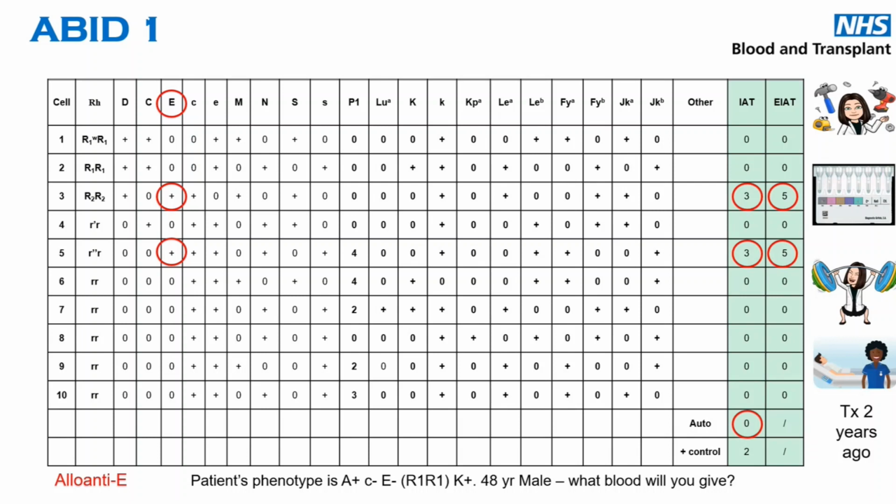So I've got an A. So what A would you give? A positive, A negative, A pos, big E neg. Any other takers? A R1, R1, Kel pos, yeah. AR1, R1 again, yeah. Yep. E neg. Just big E neg. If you were going to give a group A big E neg, would you give a little r, so a D negative, which would be little c positive?